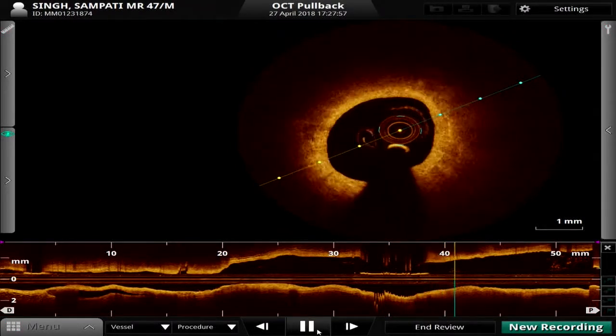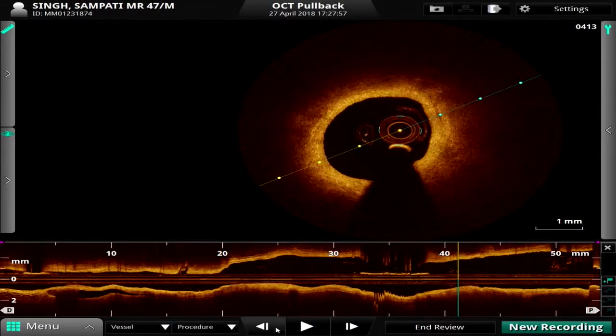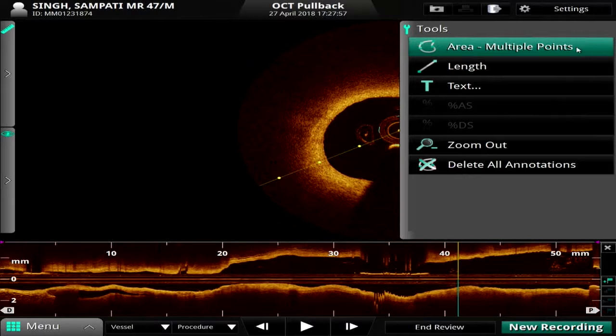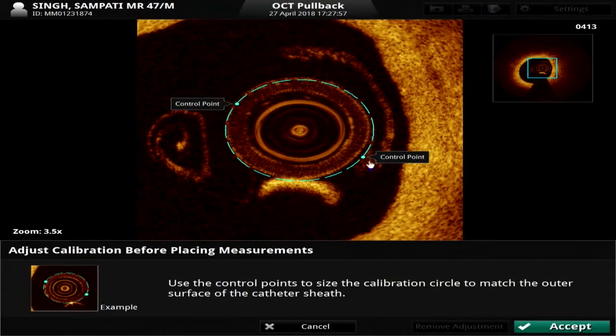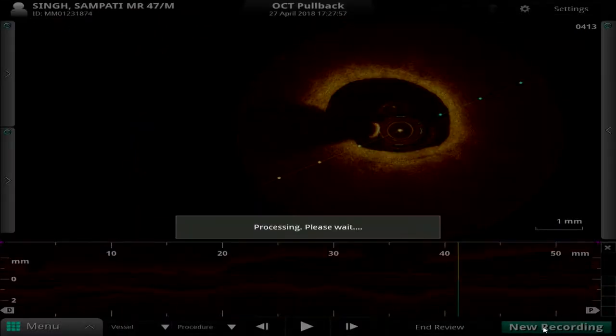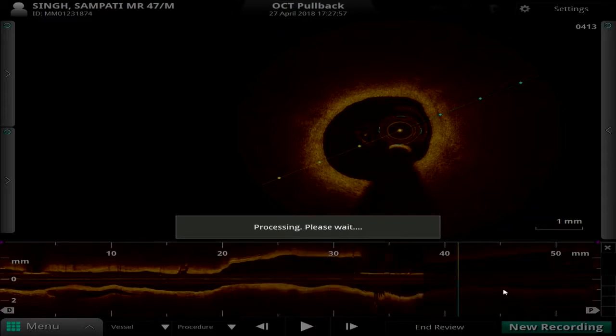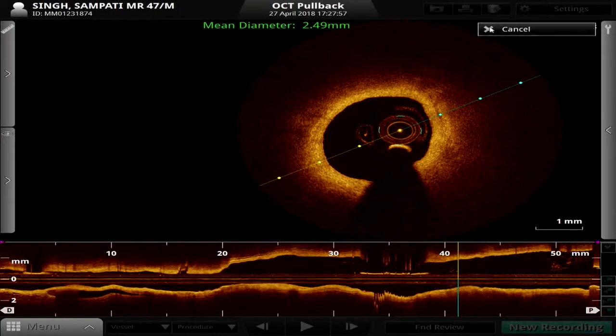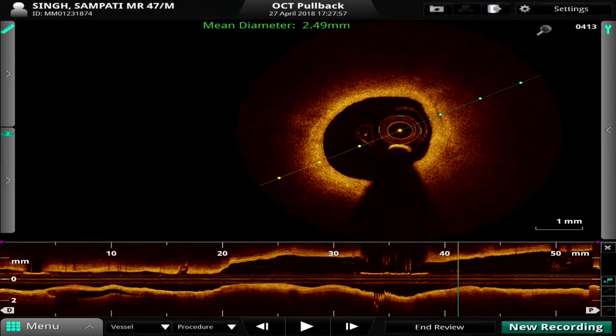Just measure the area here, maybe, yeah. So this is that part of the left main lesion on OCT. So we are going to measure the area, and we know there is a cutoff limit. So it looks like a spacious vessel here. So I don't think it's a significant lesion as it looks on angiogram, but we'll give you the figures. You measure the area here.